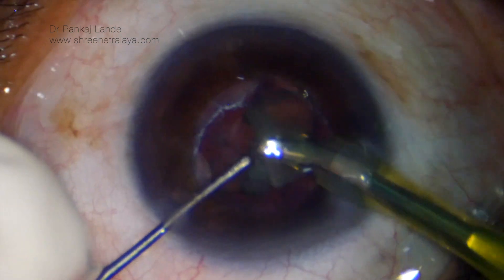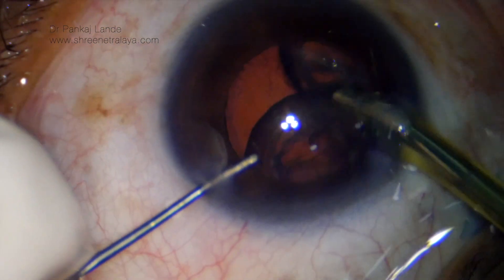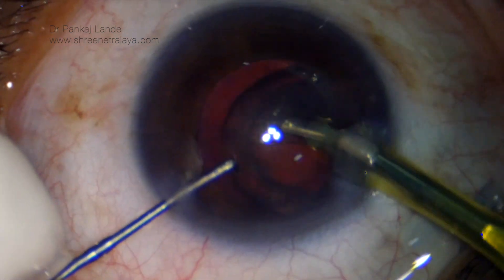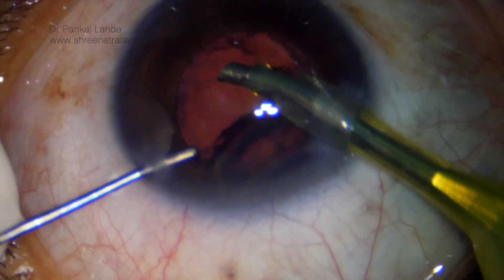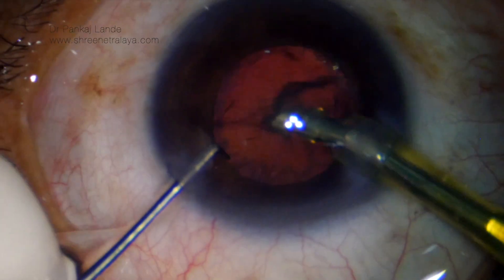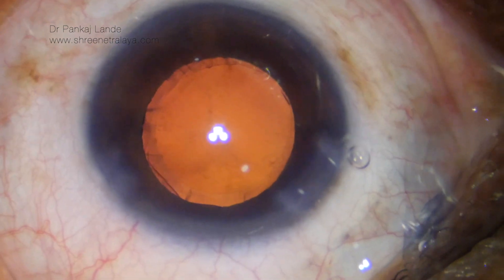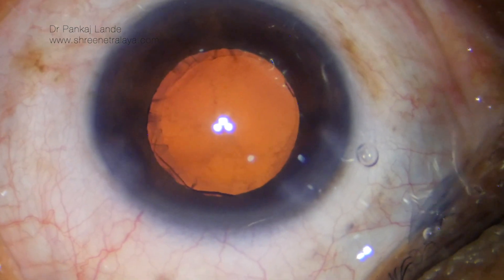When you keep your phaco tip at the center, do not go fishing in the periphery for the nuclear pieces. Use your left hand to manipulate the cortical and nuclear pieces in the anterior chamber. Note that the epinuclear plate can be taken out very easily with the phaco probe in pedal position 2.